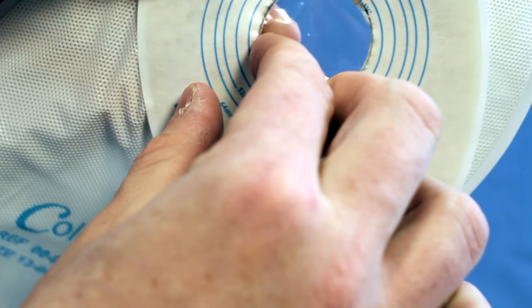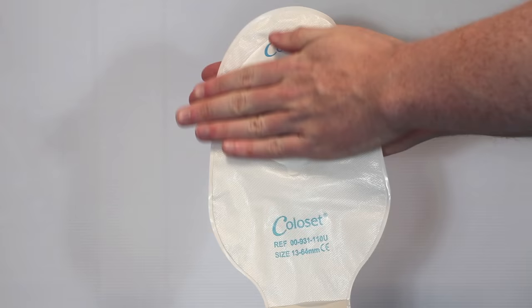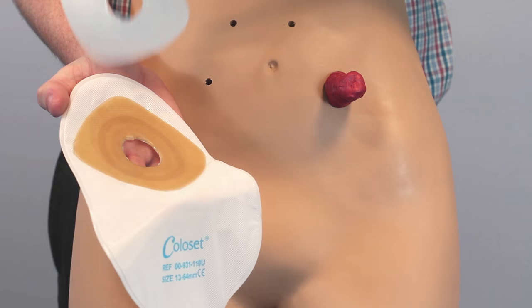Use your fingers to smooth down the edges. The pouch is now ready to be applied. The next step is to activate the adhesive by gently warming the barrier with your hands — rubbing it so that body heat and friction enhance the adhesion. Then remove the film.